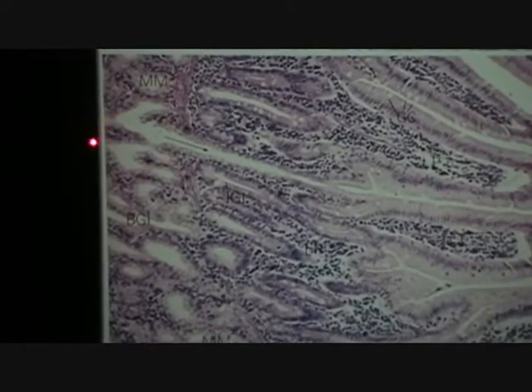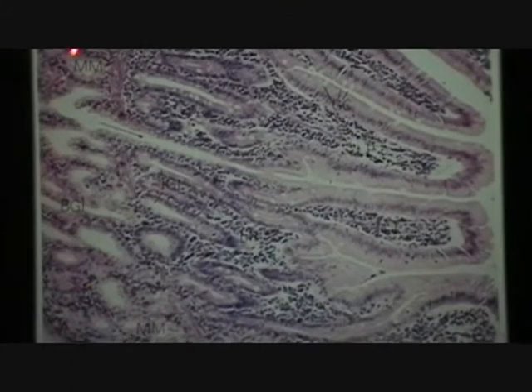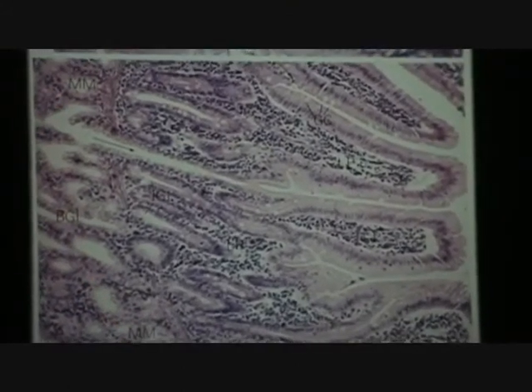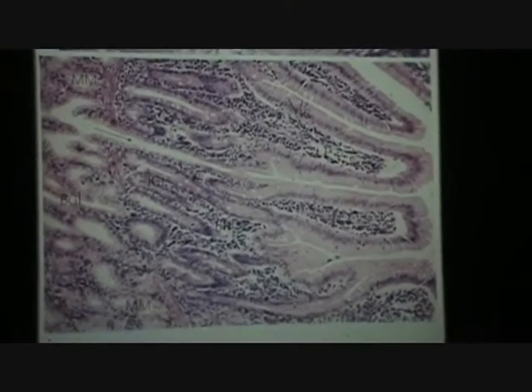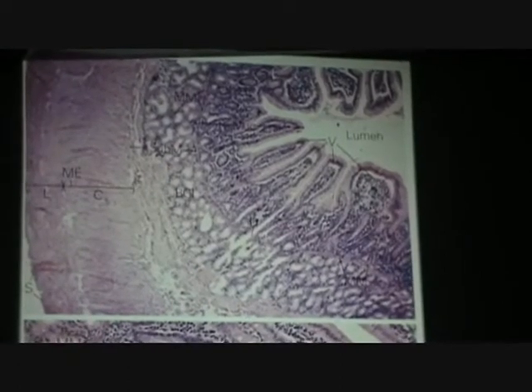And then you really should know the eponymic name for those clusters. Brunner's glands here. And we just say, you see Brunner's glands. Well, you first know it's small bowel with the villi, and you see Brunner's. Gotta be duodenum. Brunner's always adds up to duodenum.